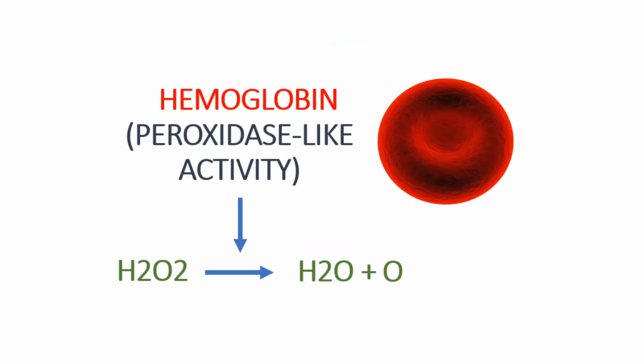Eventually, this oxygen goes and reacts with the benzidine from the benzidine powder, and this oxygen and benzidine combination is termed oxybenzidine, which changes from brown to blue. This blue oxybenzidine is the one which gives the blue color to the solution.